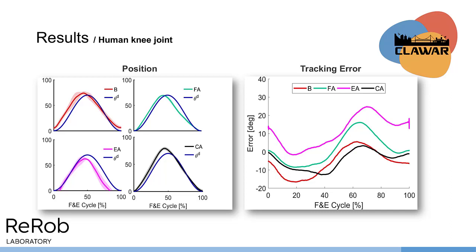of the robot assistance. During the completely assisting mode, the results were similar to BEAR mode, but with improved trajectory tracking, especially during the flexion phase. By observing the figure, we can see that in the case of completely assisted, the tracking error remained closest to 0 over time. This is expected since, in this mode, the user didn't encounter resistance to their movement.